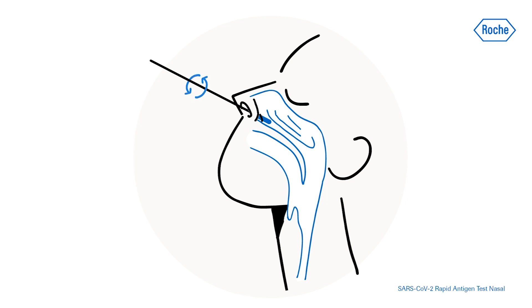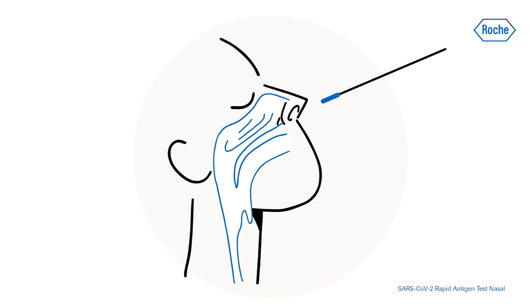Slowly rotate the swab in a circular path against the nasal wall at least four times for a minimum of 15 seconds. Repeat this with the same swab in the other nostril.